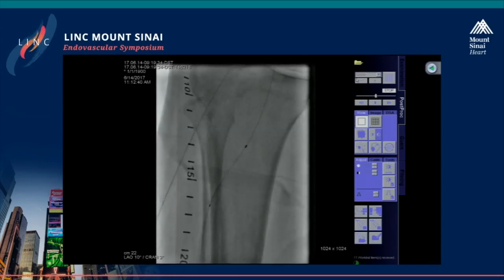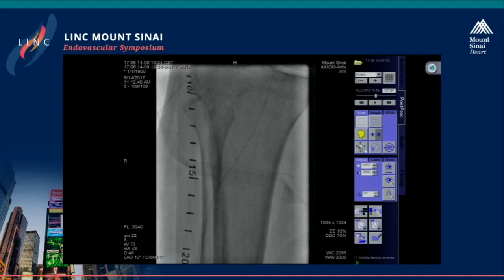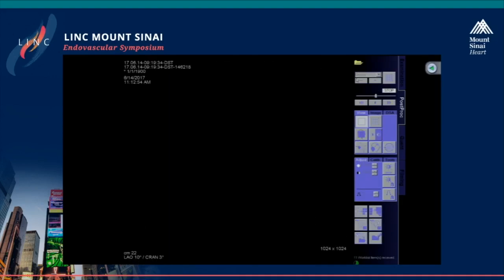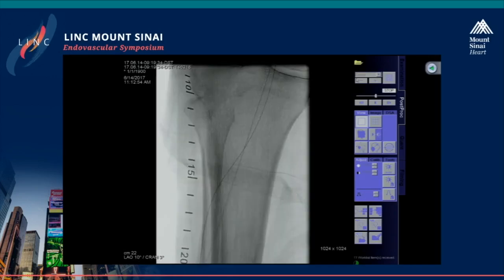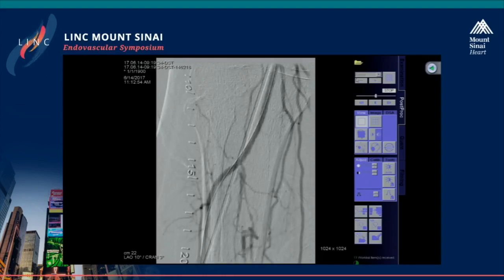250? Yeah, give another, no, 500 of ACT. Okay, walk this out. Let's do a quick DSA, guys. I know creatinine's high. There's a rule of thumb with atherectomy, especially excisional: you want to stop one cut before you perforate. That said, while that's not really feasible, IVUS is very helpful at figuring out, in my experience, when to stop, when you're done.